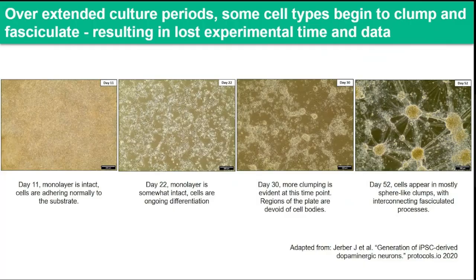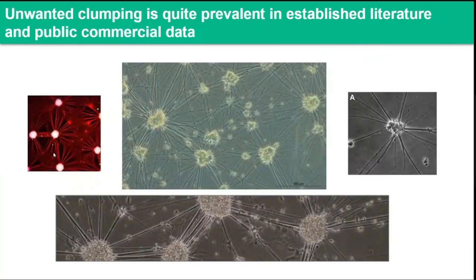And I know many of us have seen this before. We've seen it before because it's extremely common. If you look through publicly available images, vendor protocols, academic papers, and product ads, you can see this clumping everywhere. Now, clumping or 3D culture is, of course, fine if you intend to do that. But for the purposes of high content imaging, microfluidics, MEA, or anything else requiring a consistent 2D monolayer, this becomes a major failure mode. And it ruins experiments.